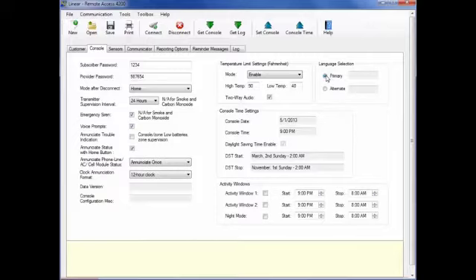Use the console time button to set the internal time and date for the console. This information is referenced when using automatic status reports, reminder messages, and activity timers. For the remaining console settings, check the defaults and change selections as desired for deployment.